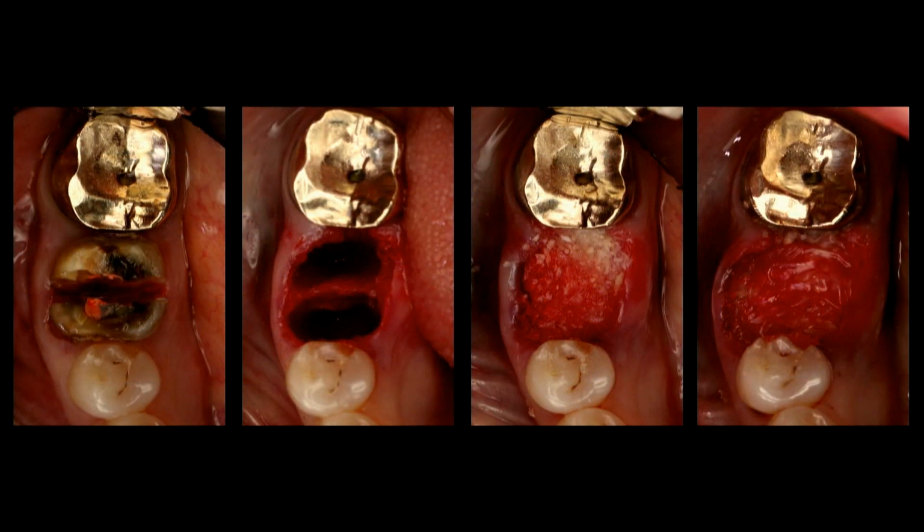All about divide and conquer, and as much as possible, I always try to do these in a flapless manner and maintain that septal bone in case I want to do an immediate implant. In this case, I chose not to. Grafted with particulate bone, and then laid the BioXclude over the larger molar site.